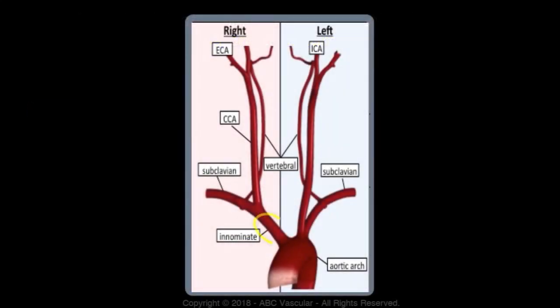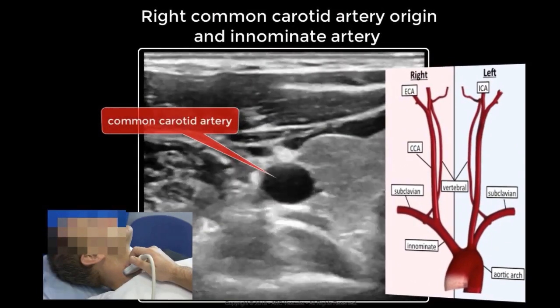While the origin of the common carotid artery can often be visualized using ultrasound, the left common carotid artery origin may not be visualized for anatomical reasons that we will now show you. Let's start from the right side.